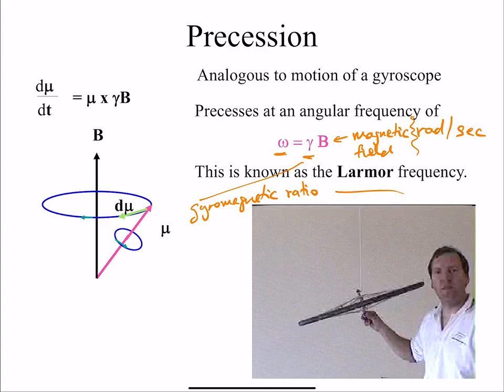Now, what we're going to find out with RF excitation: if this is a magnetic moment, it's just rotating around its own axis, but it's very hard to detect that. So in RF excitation, we want to perturb it to like here. And it's got its own angular momentum, so it's going to precess. That's the picture you need to have in mind. If I have force and also angular momentum, it gives rise to precession. This is essentially what the spins do.